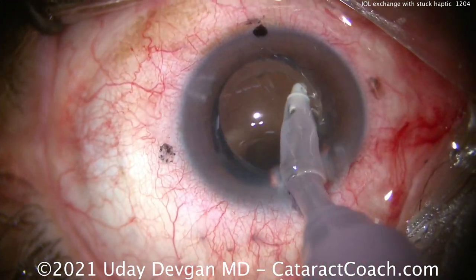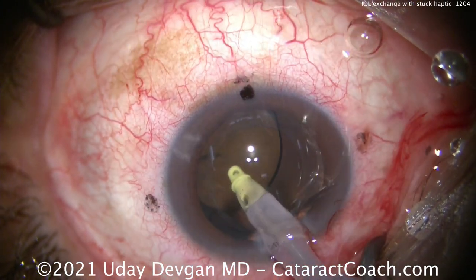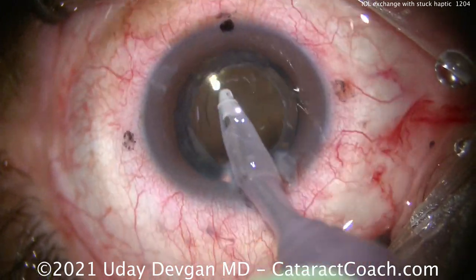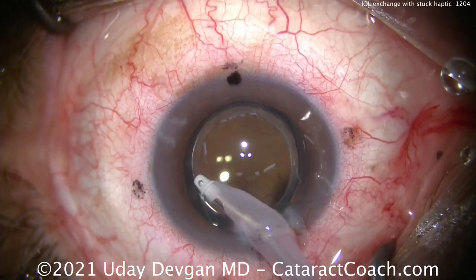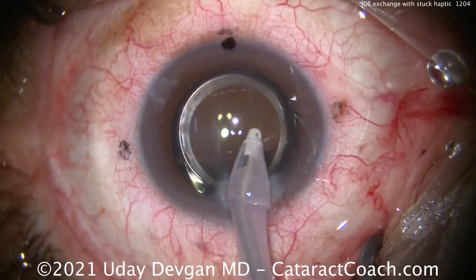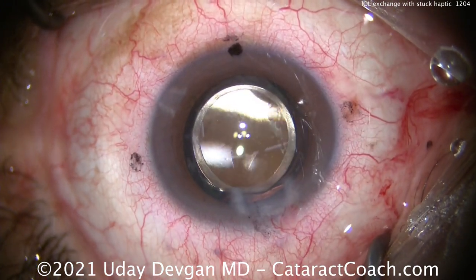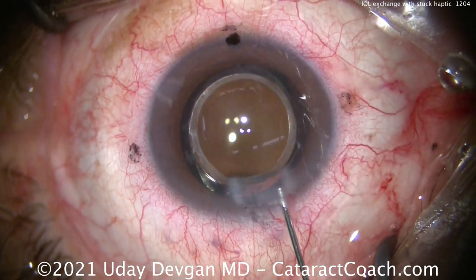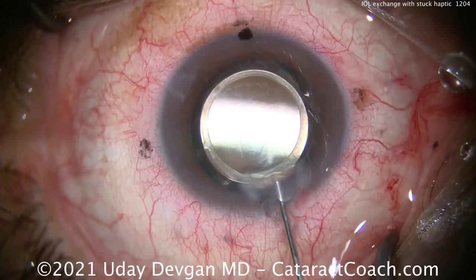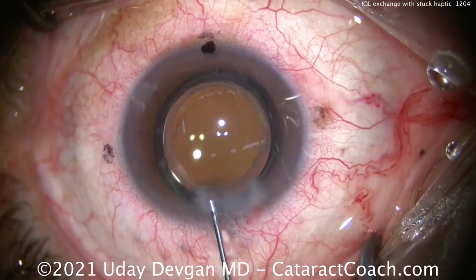Remember, any re-operation like this has more complications and higher risks than the original surgery. Oftentimes you can be surprised by weakness in certain tissues. I didn't do the original cataract surgery, so I don't know the surgeon or what was done. All I see is the results after. We want to be super cautious here. You can see there's a nice overlap of the optic by the rhexis. We protected the corneal endothelium the entire case with that dispersive viscoelastic.